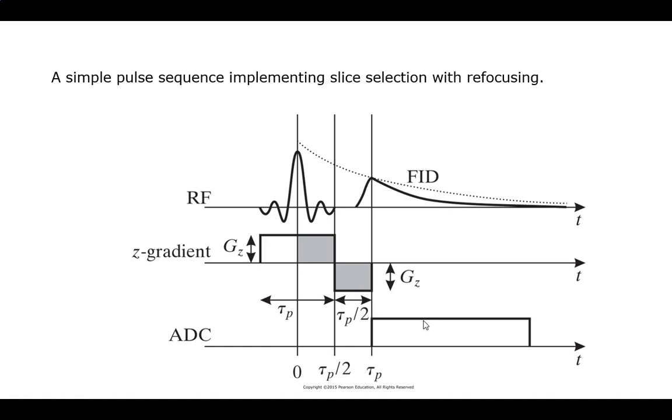Anyway, this does give one important area. This is a simple pulse sequence that's coming on here. What really does matter is the timing of this, plus the correction to get to them, which is actually important. Here you can see we're centering it with the RF pulse. We do want it to be half that length. It's not necessarily perfect like that. You do get your GZ peaks off of those. And then on a basic one, this is if you're just looking for the FID decay. Remember this is T2 and that's T2 star. That's the difference between the two lines.